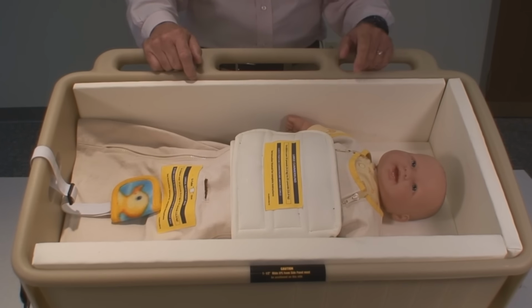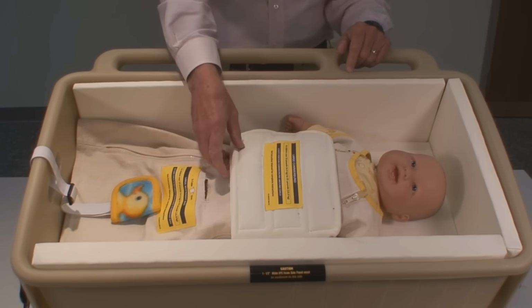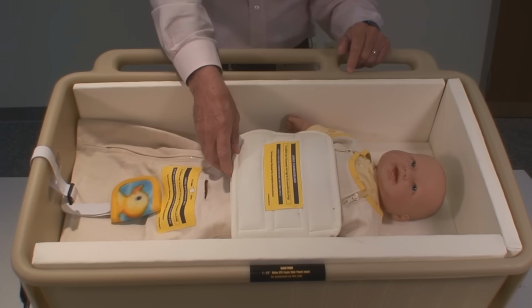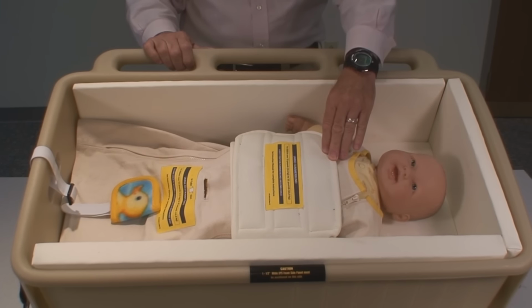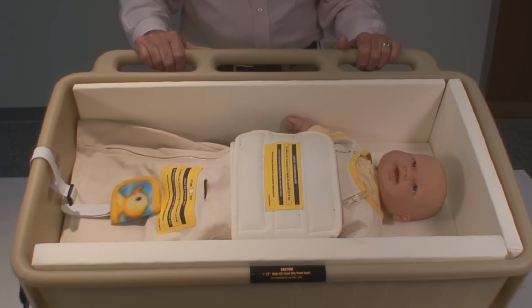In addition to the large and small restraint bag, there's a large and small cummerbund. The small cummerbund has to be used with the small restraint bag, and the large cummerbund has to be used with the large restraint bag. It also has a 3-point harness that you can use once you take the restraint bag out.